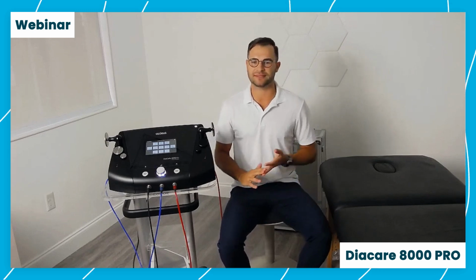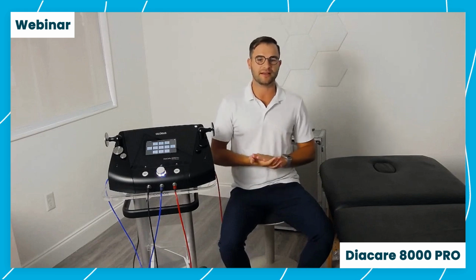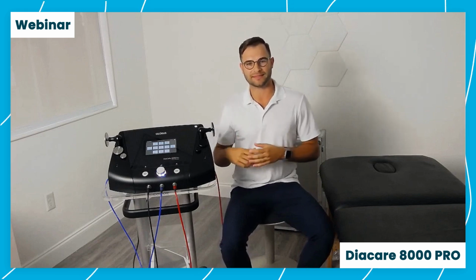Moving on, intensity, the power of the machine. This machine is very powerful. Our Diacare 8000 can generate 350 watts of power, and that's delivered throughout the entire treatment. Now, as you know or are learning, you are changing the power throughout the treatment. You get to choose between 0 and 100% of the power that this machine can deliver.